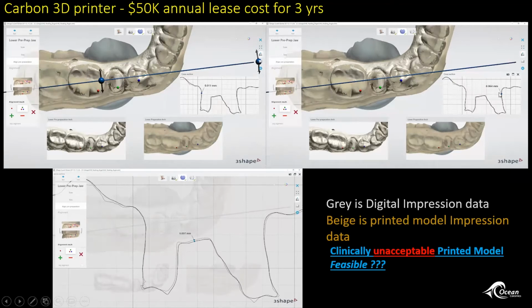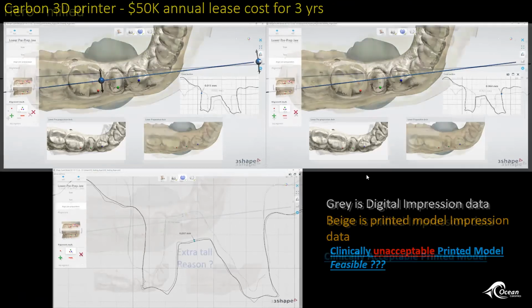Okay. So what concerns me there is that one was good and the other one was not too great. I'm always looking for things to be in the ballpark, whatever dimension I'm looking at when it's a contact. Anyhow, I wasn't too impressed there, but hey, it is what it is.